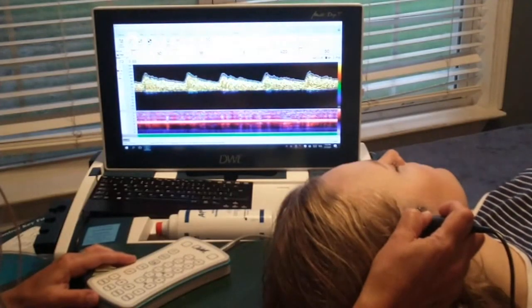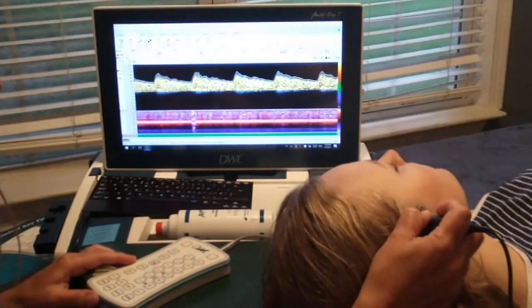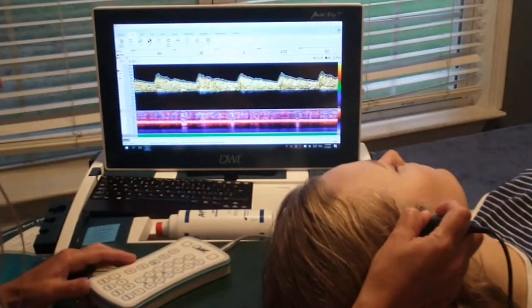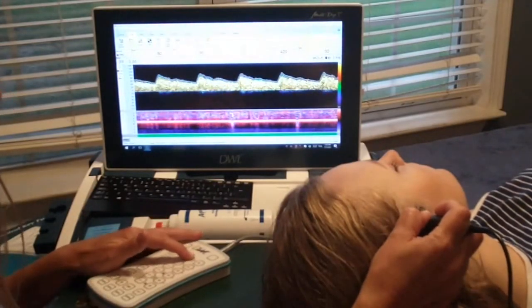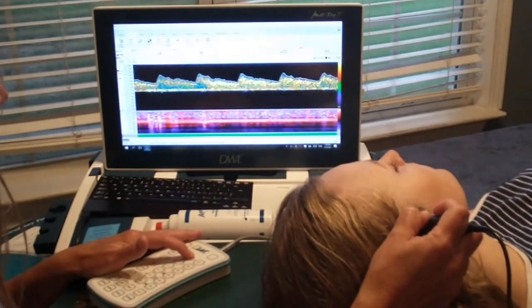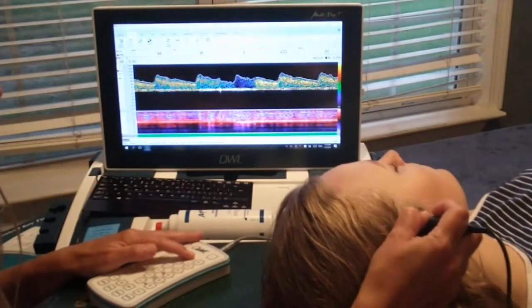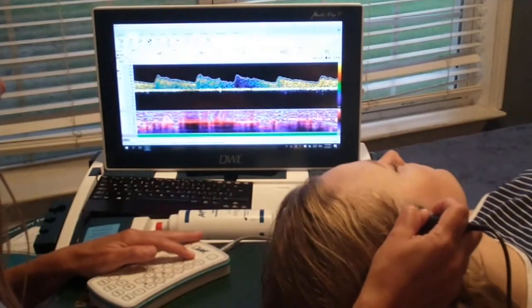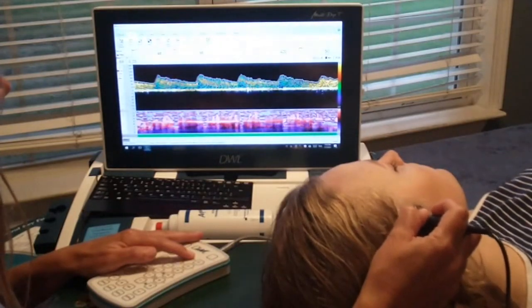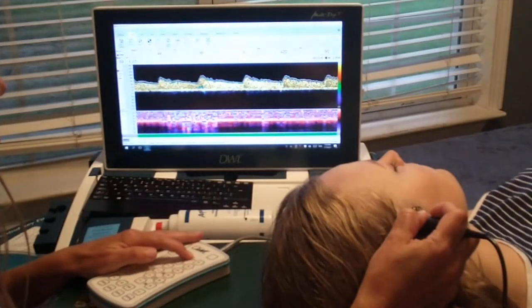When you have found your highest mean and your nice strong signal, you're going to take your depth down as superficially as you can while maintaining an optimal image. To decrease your depth, you're going to hit the button 1 on your remote, and you're going to watch your depth change. You're going to rotate your probe to maintain a nice image as you decrease your depth.